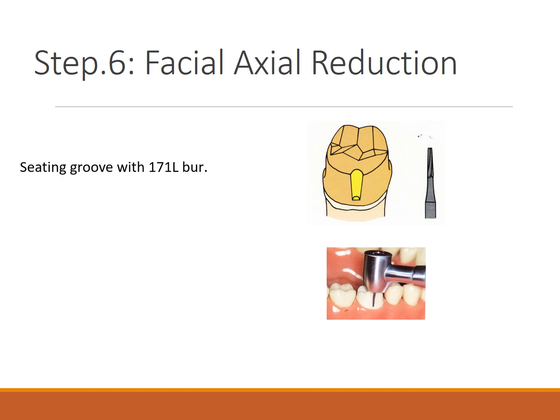So guys, always remember never to over taper the preparation, never to taper too much, and try not to over reduce any of the preparations. Take care of the angulation of the burr. You have to learn the control of the burr, and then you'll be able to produce a good morphology.